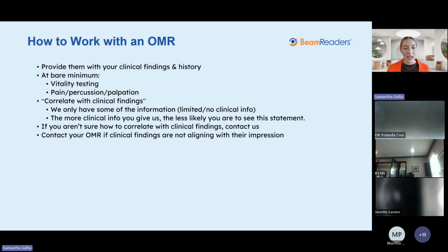And all this to say, one final note before we dive into the DTX software: radiologists are writing a report for many different eyes. We're writing it for you, the dentist. There are also other specialists who can see that if you end up passing that report on. We don't know if you did the work or if another specialist did the work. And a lot of times the patient ends up seeing the report too. So there are certain things that we have to dance our verbiage around.